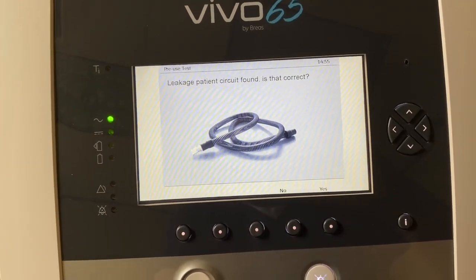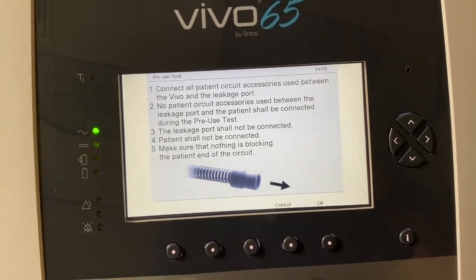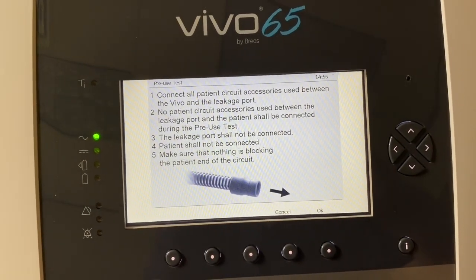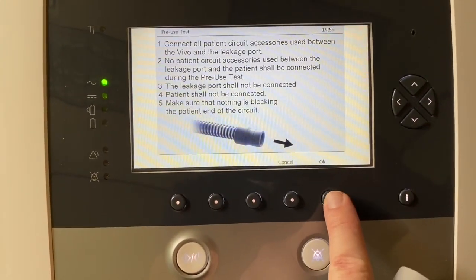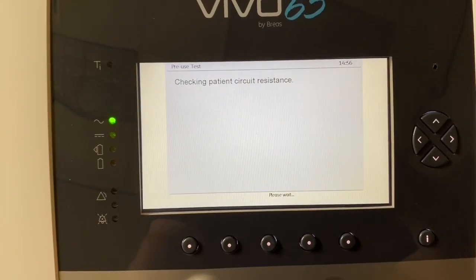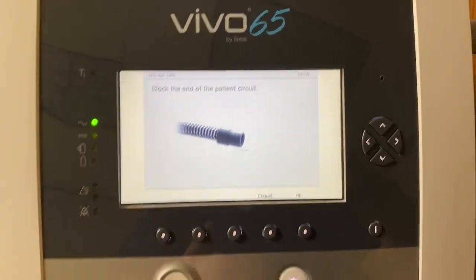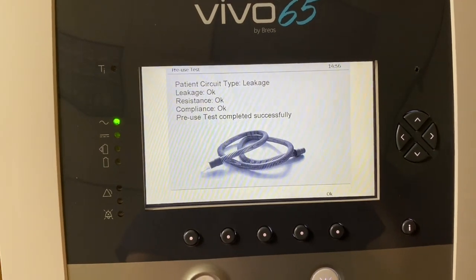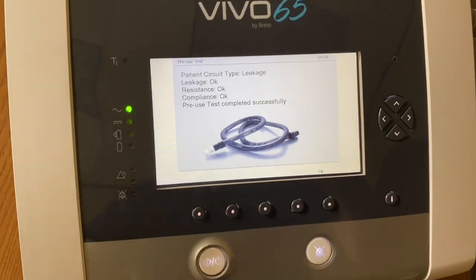It's identifying that this is a leakage patient circuit — that is correct. It's saying to connect all patient circuit accessories used between the Vivo and the leakage port. No patient circuit accessories used between the leakage port and the patient shall be connected, and the leakage port shall also not be connected. So nothing is connected right now for this test. It's just checking the resistance and then compliance of the tubing. Then it will have me block the end, and now it is checking the compliance and verifying that there is no leak through the circuit. Pre-use test is successful.